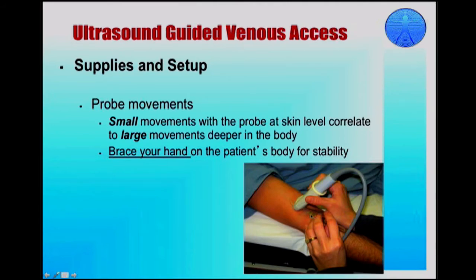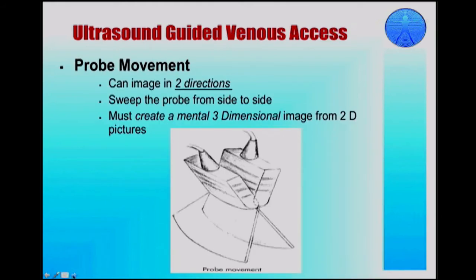She's having a hard time doing that because she's sticking her needle right underneath there, so she's got her hand elevated a little bit, but notice that she's also bracing her needle hand too. So brace your hand on the patient, hold the probe as low as you can, and place the needle right underneath the probe, which we'll talk about in a few minutes, but brace your hand on the skin. That way, without looking at your hands, you know where your hands are, your probe is, and also where your needle is, all at the same time.